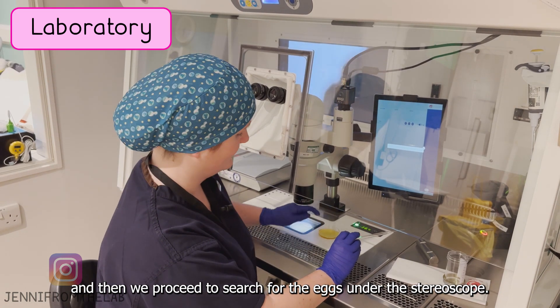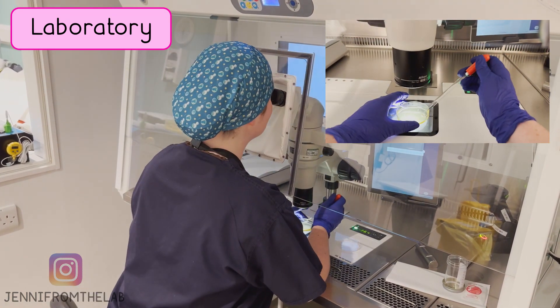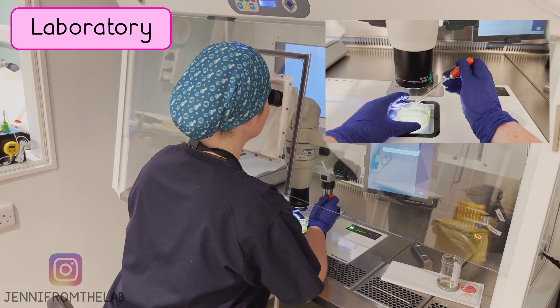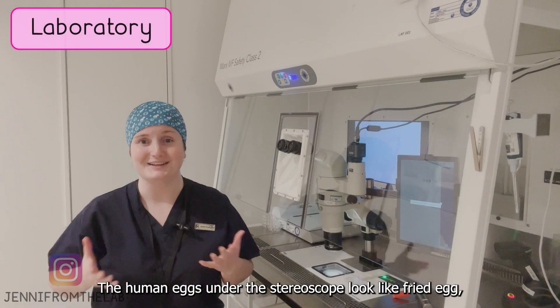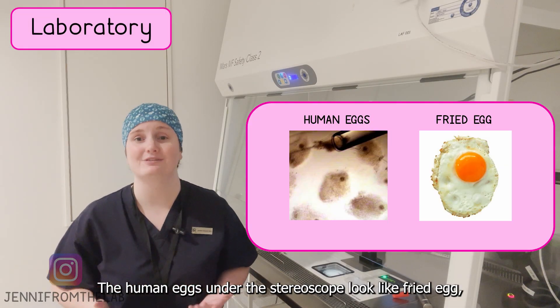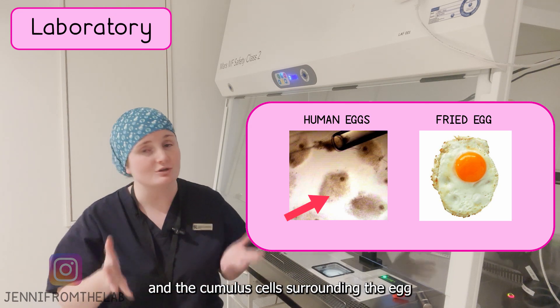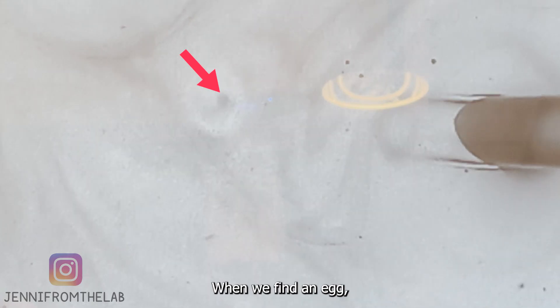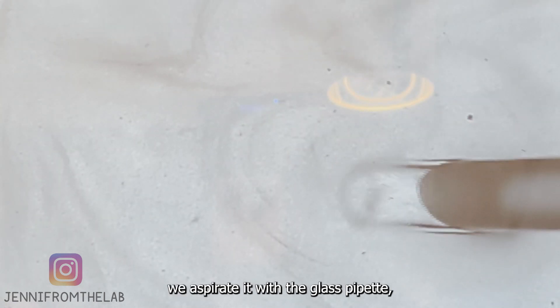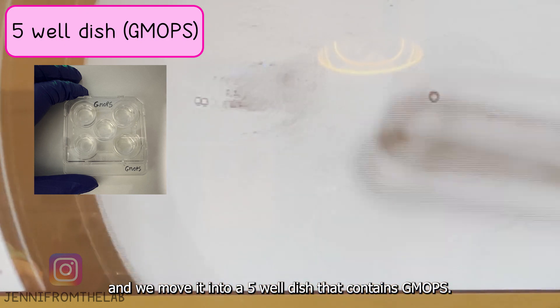We then proceed to search for the eggs under the stereoscope. The human egg under the stereoscope looks like a fried egg — the egg would be the yolk and the cumulus cells surrounding the egg would be the egg white. When we find an egg, we aspirate it with a glass pipette and move it into a 5-well dish that contains GMOPS.